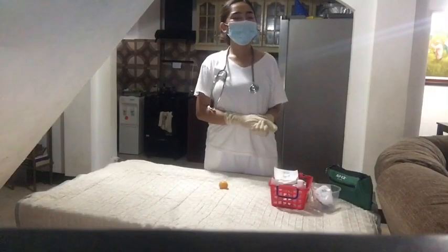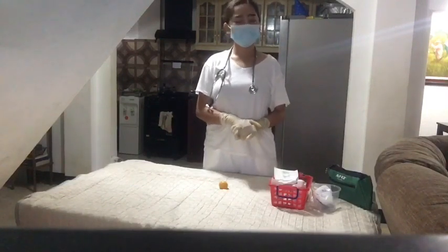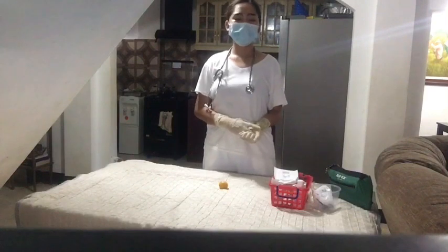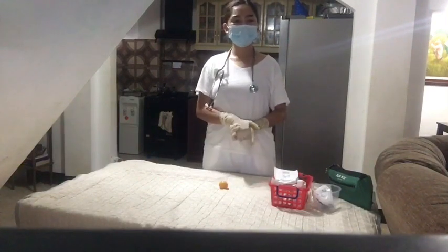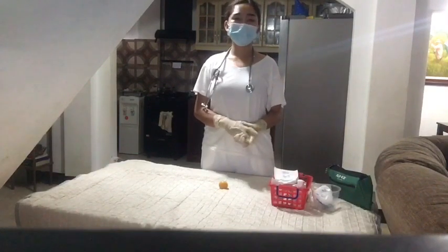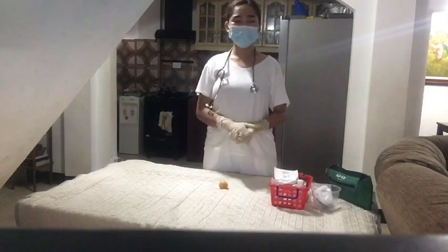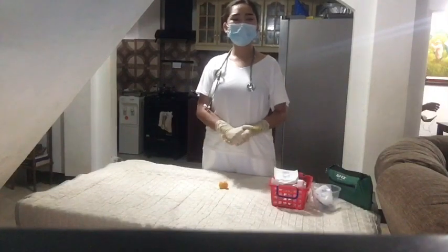Now we will be demonstrating or administering subcutaneous injection. So the first step is to perform hand hygiene and observe the appropriate infection control procedures. This is to reduce the number of microorganisms on the hands. Since we are done washing our hands, we will now proceed to the next step.